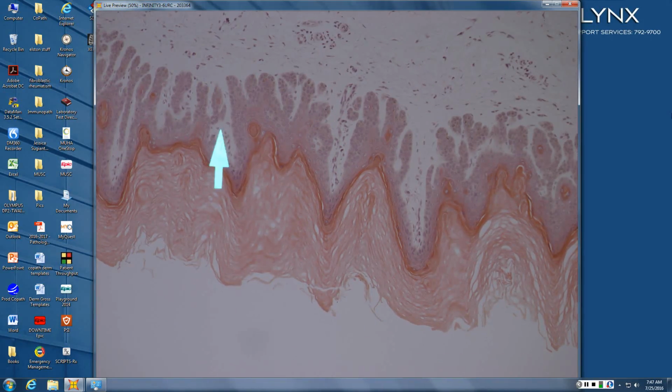And then it has little horn cysts. The keratin is fairly compact, but breaks up into a lamellar shredded wheat pattern, so it is good for a seb keratin. This patient is from Australia, and so is shown in true anatomic position, head downward, right, with the corneum down.